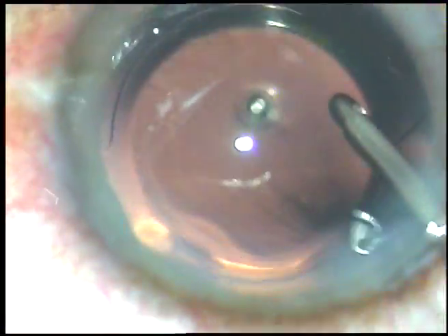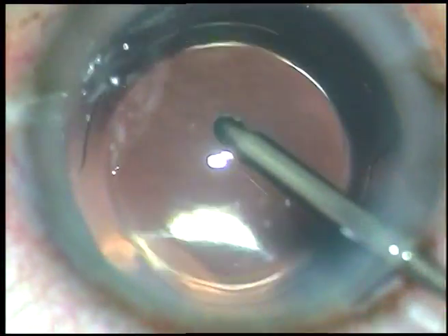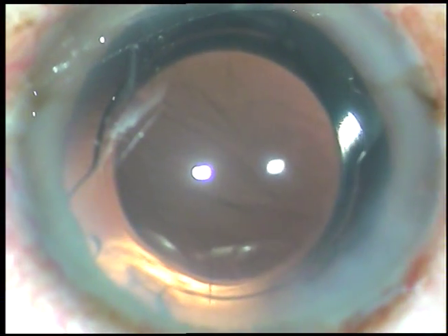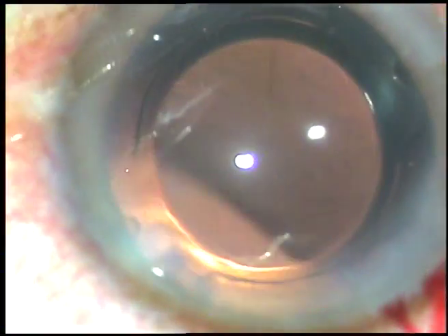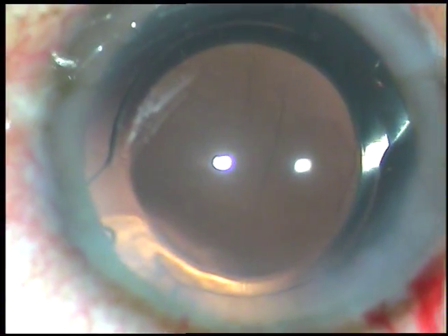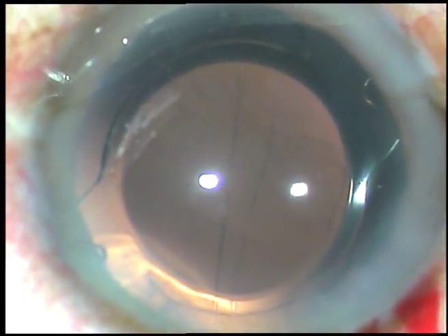The anterior chamber and the capsular bag are irrigated because there is some viscoelastic substance in the lumen of the cartridge. Now this is a bit of moxifloxacin — though this step can be avoided. And now this is hydration of the side ports to make these stab wounds waterproof.